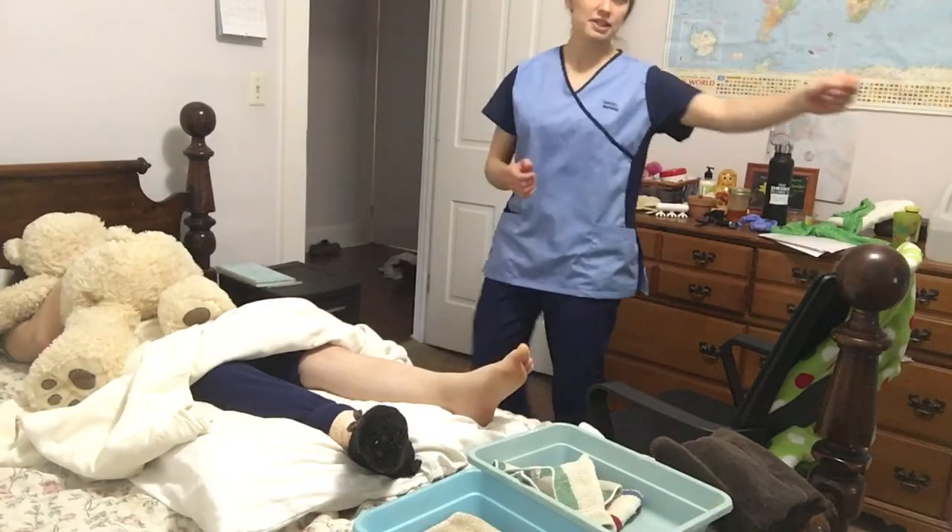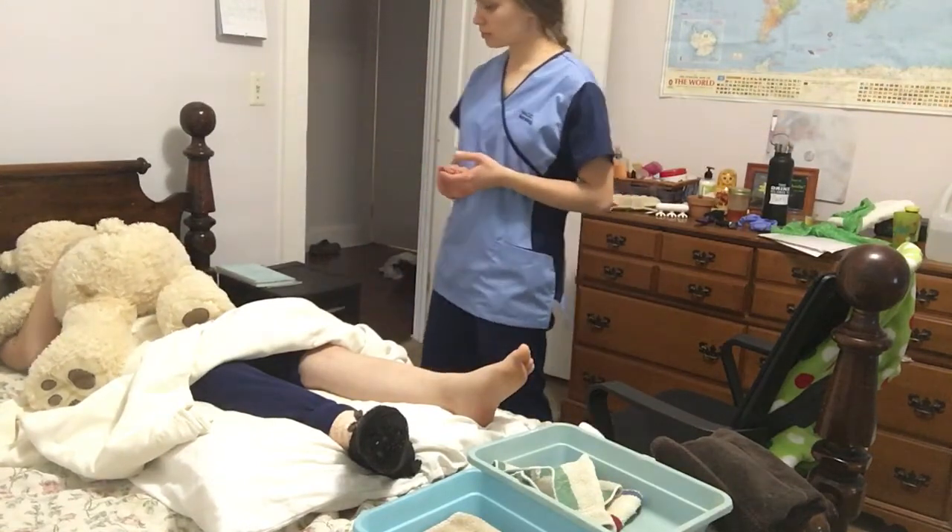I'm going to pull the privacy curtain. Do you have any allergies? Okay.